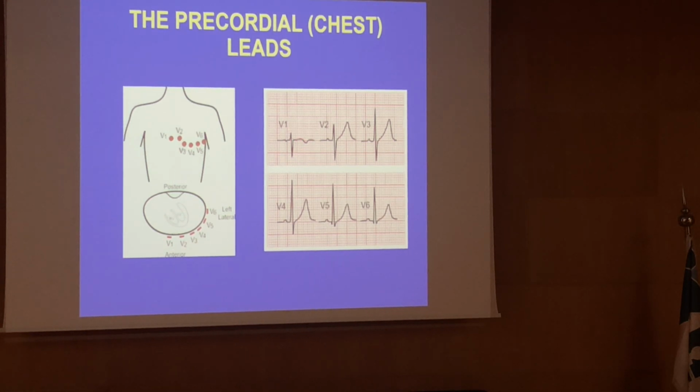You see, the P wave in V1 can be negative, where the wave of depolarization is moving away. So normally it can be biphasic or negative in V1. The normal repolarization wave in V1 is negative. We always try to look at depolarization because repolarization is very variable. So we don't usually discuss the T wave, except in ischemia, which we'll discuss later. But normally the T wave can be negative in V1, sometimes up to V3 in young people, and in adulthood only V1 and V2 can be negative, others can be positive. So there are changes with age.